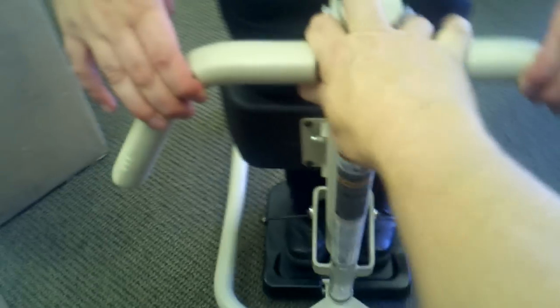The easiest way to move someone — and remember I'm using one hand to do this, so obviously if I was a lot weaker I could use two hands no problem. Sometimes it's easier to go backwards, but the important thing is to always get the four wheels going in the same direction. And one of the biggest mistakes that get people hurt: always lock the wheels if you're letting them sit for even a small period of time — you can easily push down to lock them.